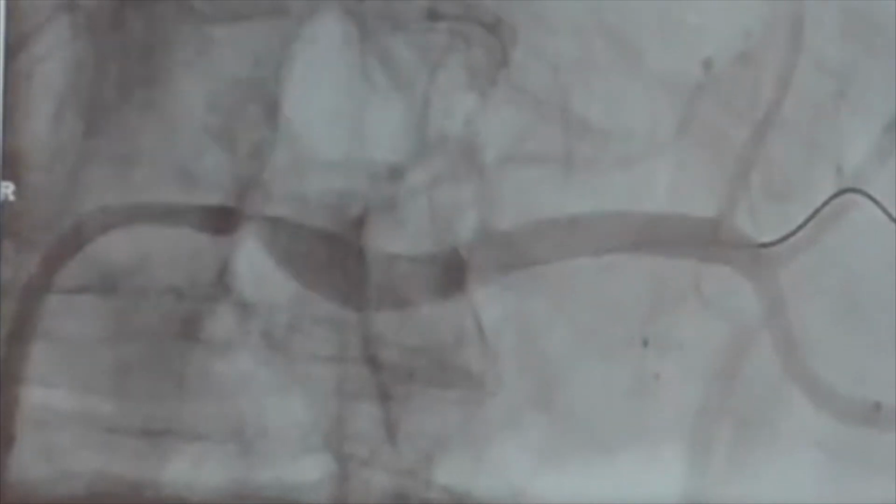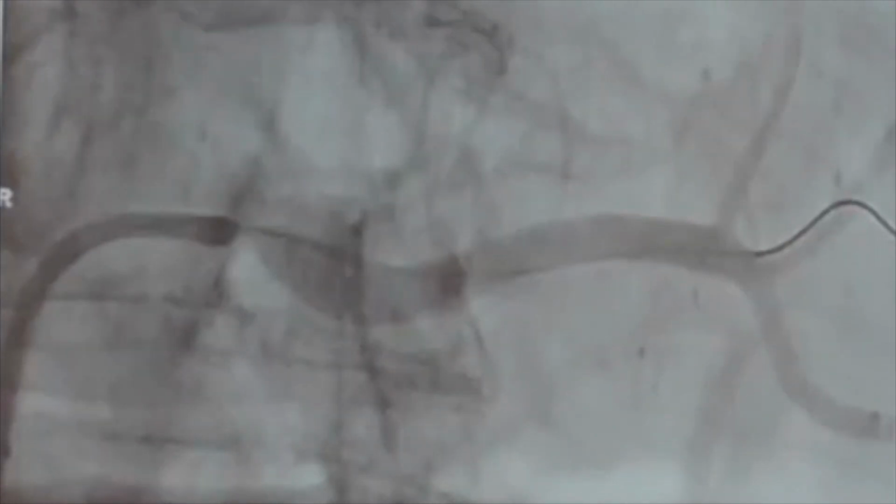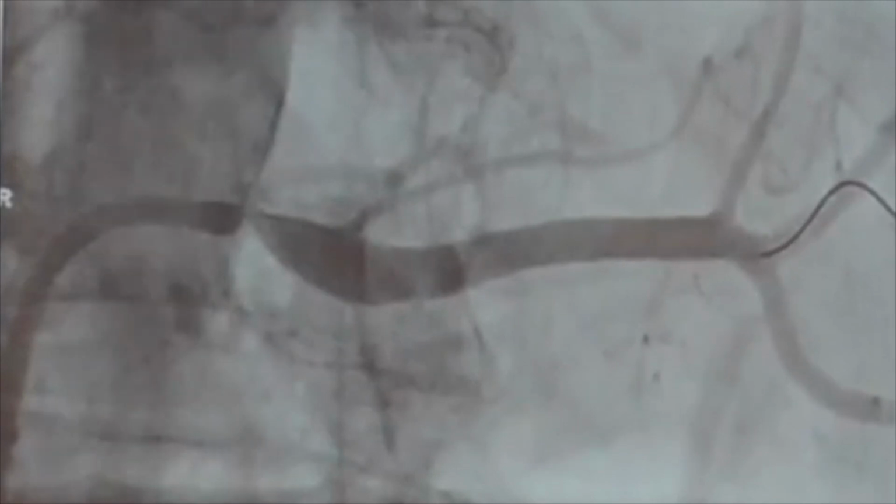This is a case of Professor Thomas Zeller, with whom I worked in renal artery stenting in Bad Kreuznach, Germany. And he's also written a chapter of renal artery stenting in the EuroPCR book. So in this case, the left renal artery had critical osteal stenosis. There's eccentric calcium that is seen in the ostia.